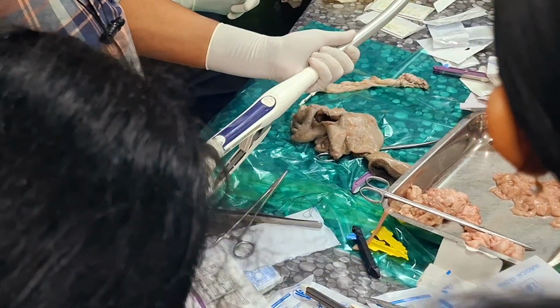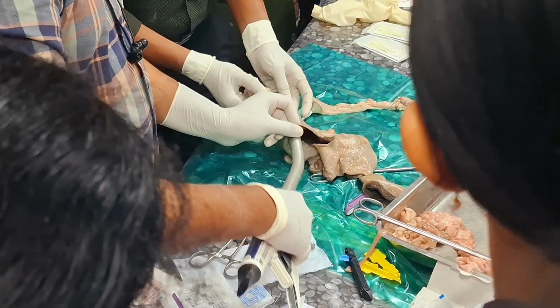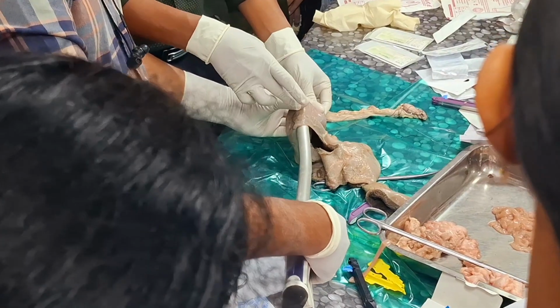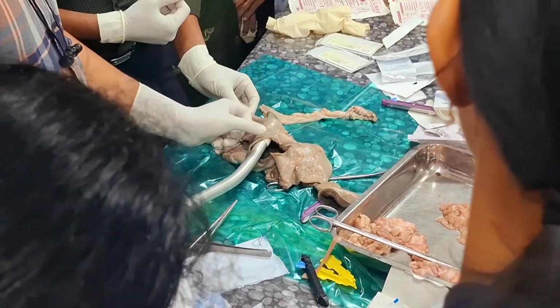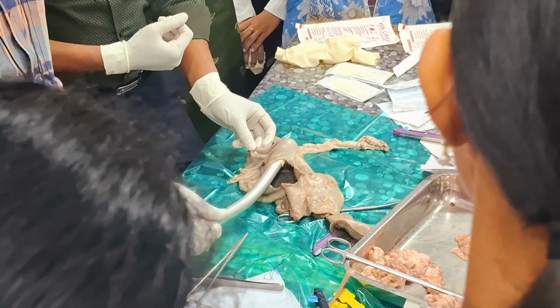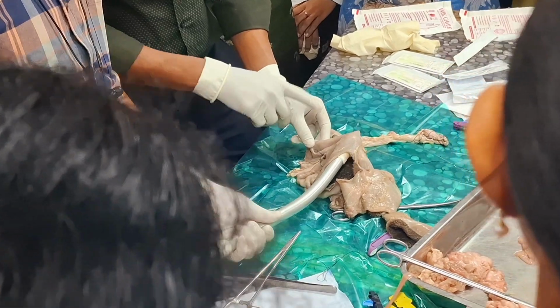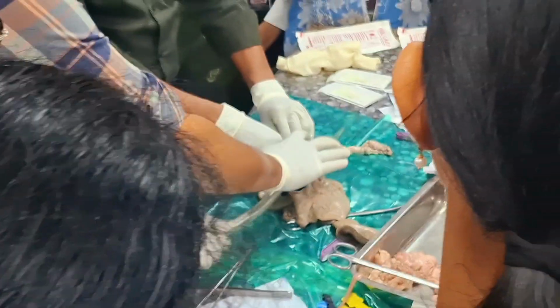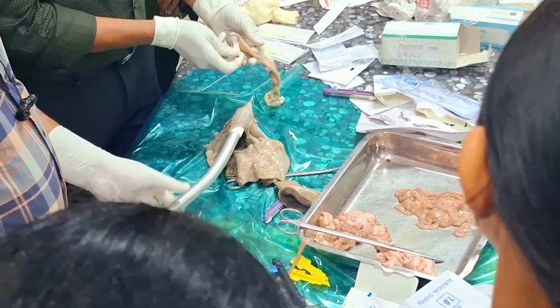The use of this is, if you already have an opening, then you can just go and keep that opening there. Otherwise, if you don't have an opening there, but still you want to do an end-to-end anastomosis, it comes from below and that will pierce that. Assume this is an end, so that this will engage with this one.